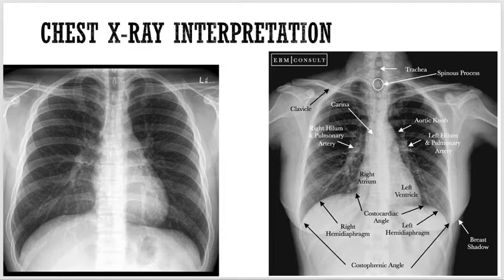Now you can see this is an X-ray of a female, and you can see her breast here and here. See the breast tissue. Breast is soft tissue, right? So you can see a slightly grayish color over here.